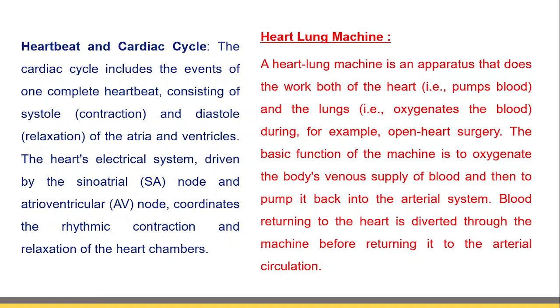So our objective is to study the heart-lung machines and the conditions for using them. The heart-lung machine is an apparatus that does the work of both the heart and lungs. So it replaces the heart and lungs during cardiac surgery. The heart pumps the blood, and the lungs oxygenate the blood. We can replace both functions with the heart-lung machine.